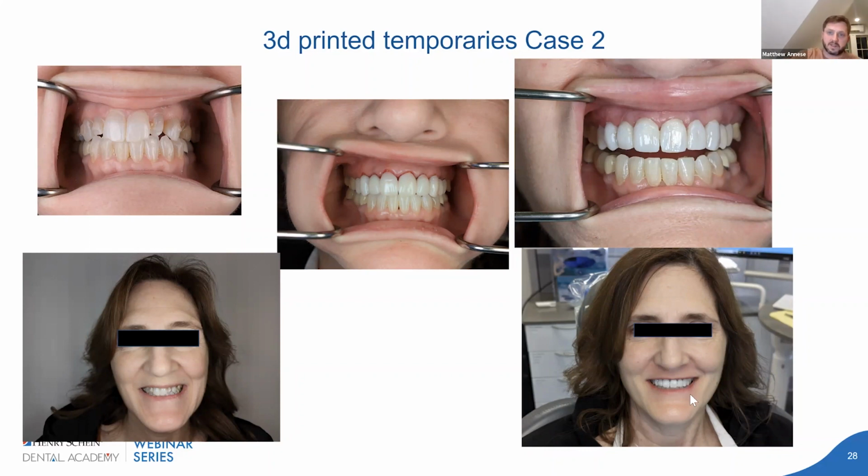And then the patient still had, like, she wanted some tweaks and changes and all this. Number 7, number 10 looks a little bit too big, and basically, trying to calm them down and appease them, hey, we're getting the lab tech to sit there like, hey, this is what they perfected from here. We just get them pretty close with these 3D printed temporaries.